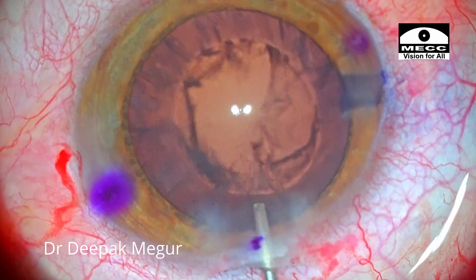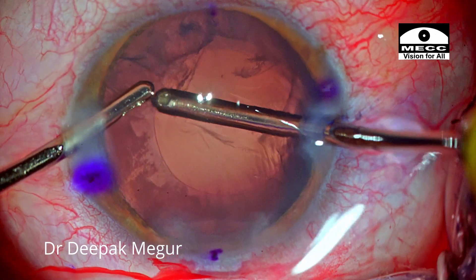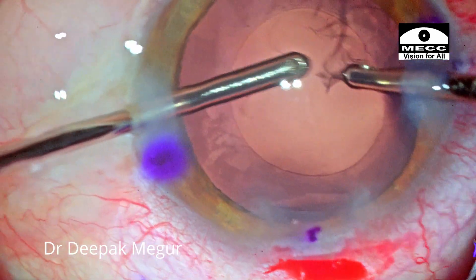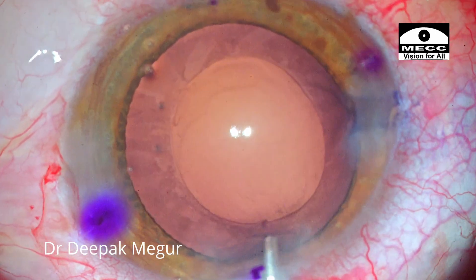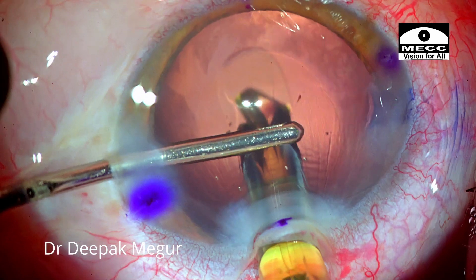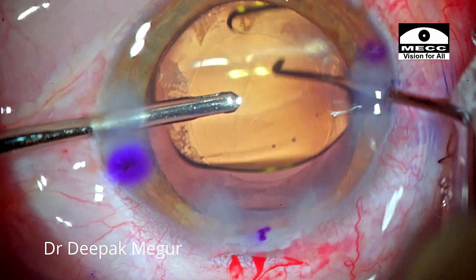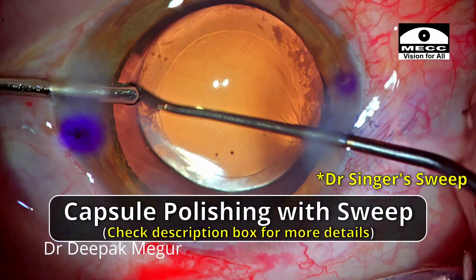Similarly, the cortex is aspirated out. The posterior capsule is polished with a jet of BSS. Hydro-implantation of the toric IOL into the bag is being done. With the irrigation in one hand, the anterior capsule is polished.